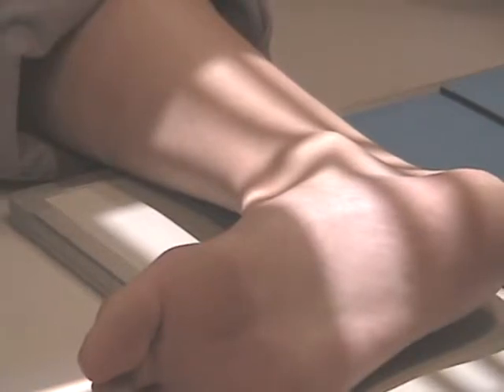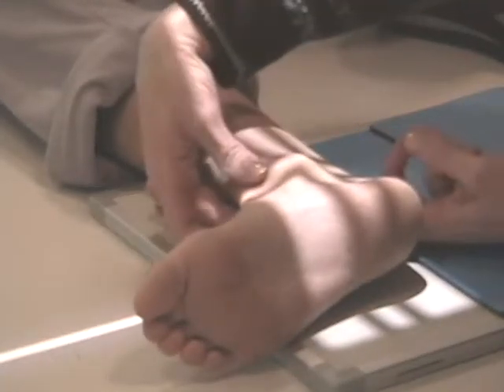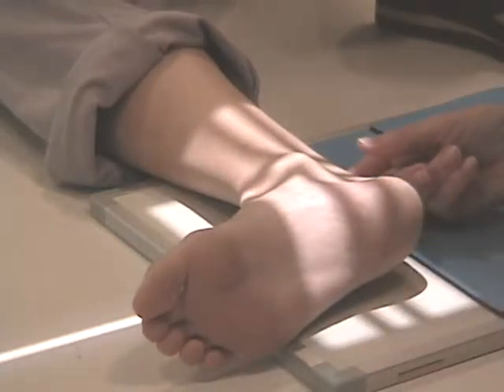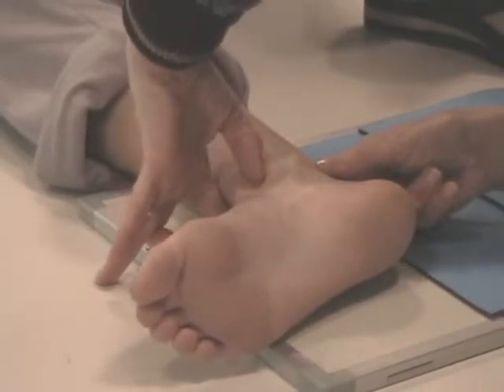And what I need to do now, I'm going to switch my position. I have positioned the ankle. I want the malleoli superimposed one on top of the other. I'm going to try to make sure you can see what I'm trying to do here. I feel for the malleolar line. I do not pinch the patient.